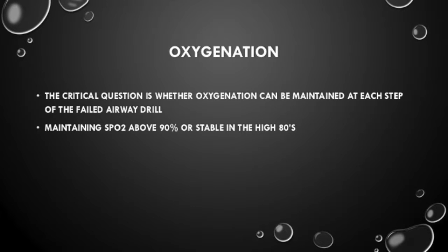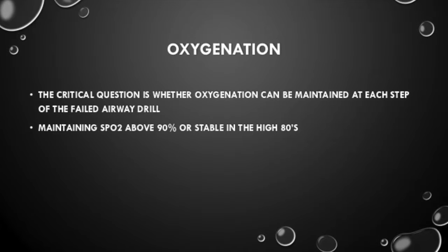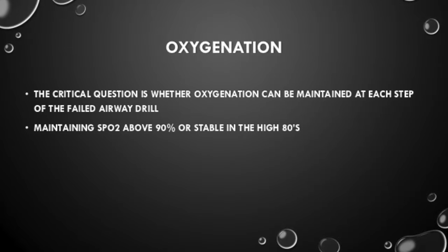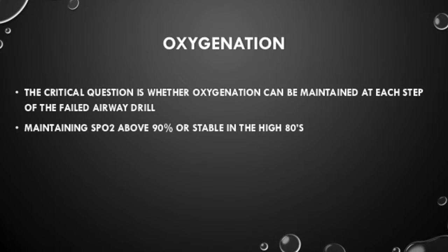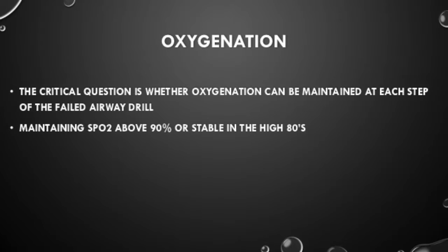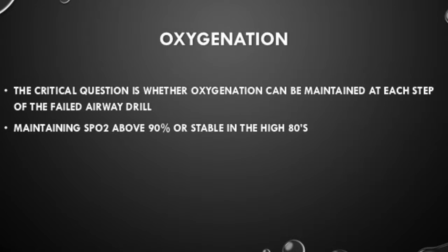The critical question here for each procedure is whether you can oxygenate the patient. Ideally, you want to keep them at greater than 90% SATs, and if you're unable to, you need to move on, and I'll explain why SATs of less than 90% are critical to the patient.